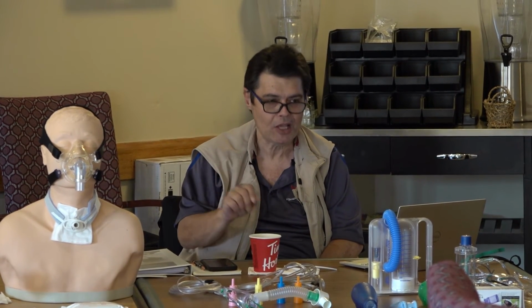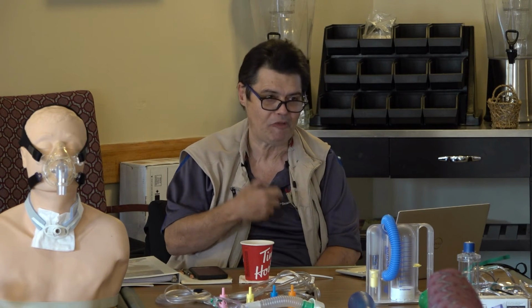And this setup can be used on really two types of patients. One, your trach patient, and secondly, your patient with thick viscous secretions, where you need extra humidity to liquefy the secretions, making it easier for him to actually cough and get rid of them.